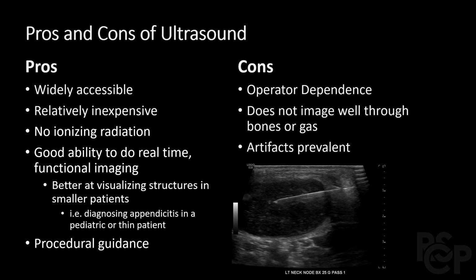One con is that it is very operator dependent, so you must be skilled in ultrasound and able to obtain proper imaging. It also does not image well through bones or gas, and artifacts can be prevalent.